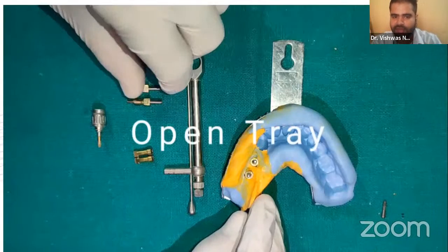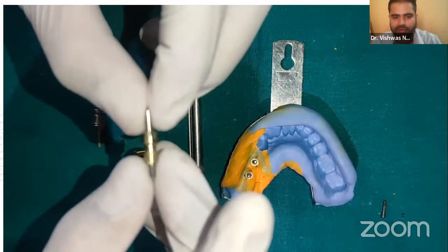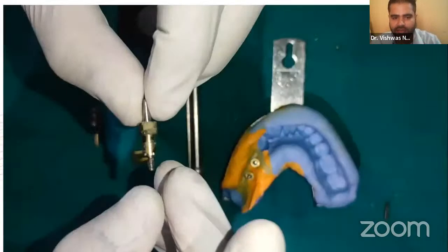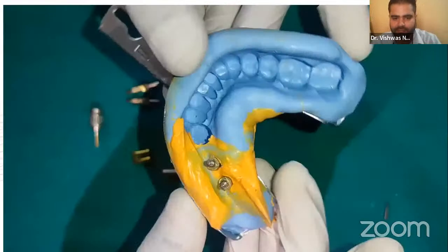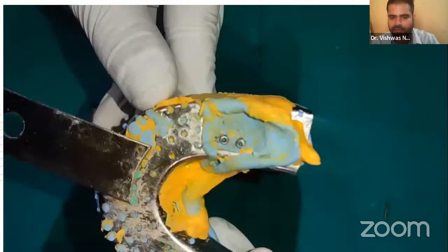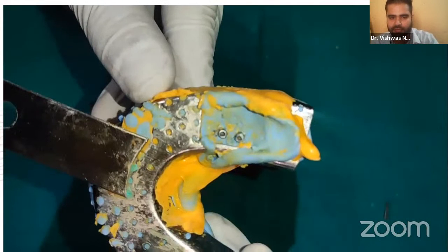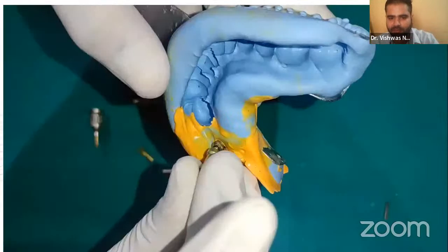So this is how we attach the analog to the open tray coping. This is the coping. You can appreciate the undercuts that will help it engage the impression material. On the back side of the impression, you can see the channels from which they can be screwed and unscrewed. We apply the analog onto the position.